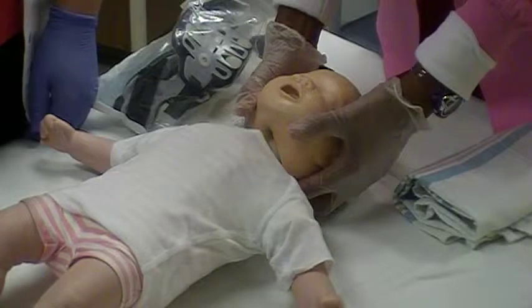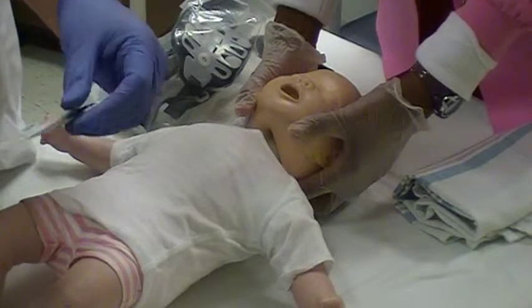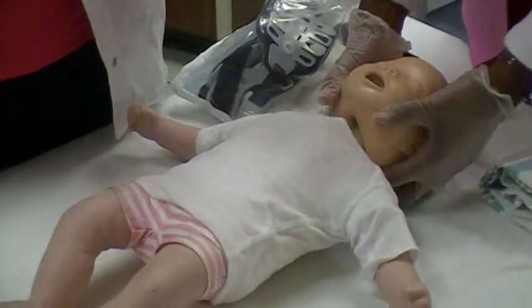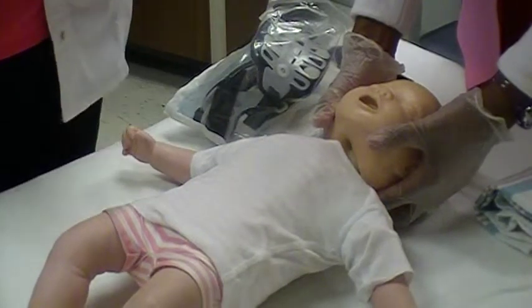Select the appropriate collar based on the child's age, height, and weight. See sizing guides specific to the collar. Children's collars are based on height, age, and weight.